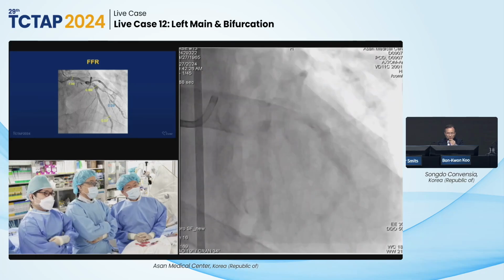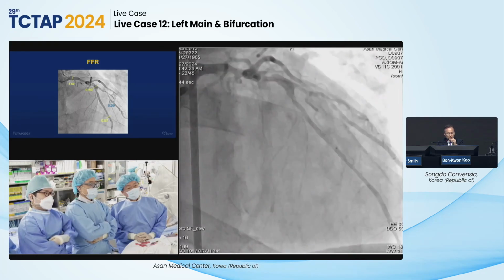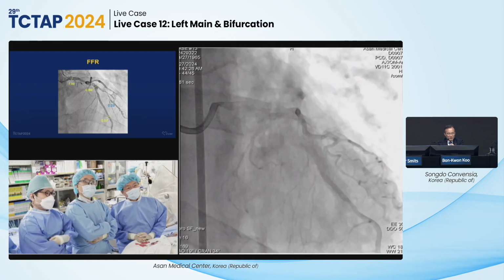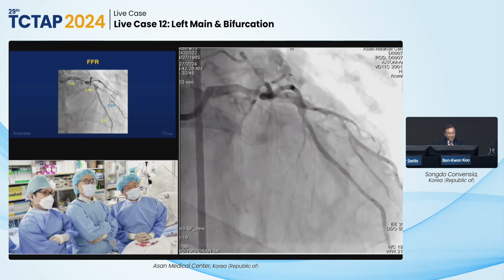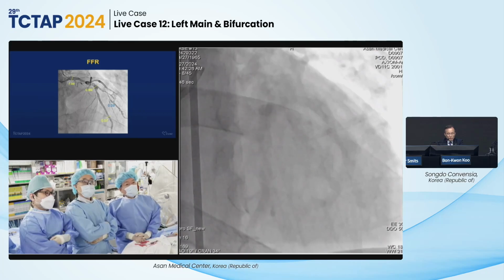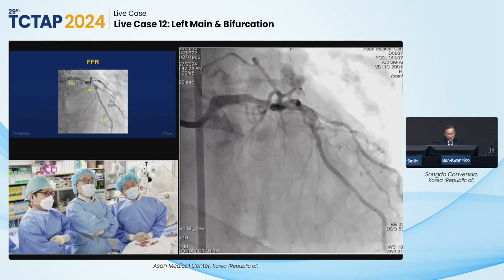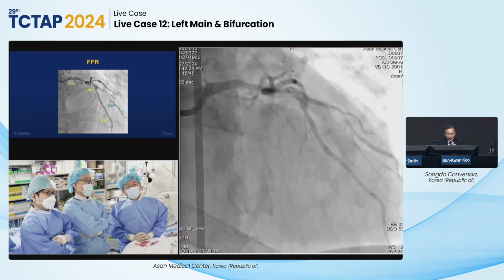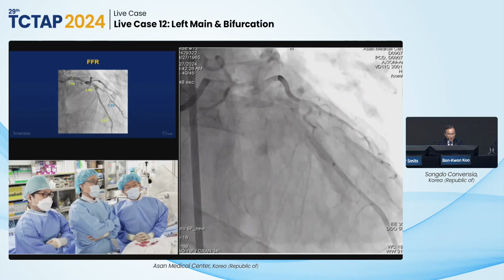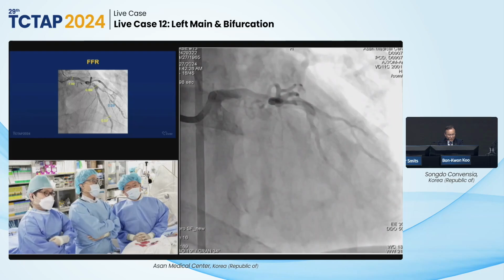And as Dr. Werner said, the delta of the distal lesion, 0.69 minus 0.57, will increase after fixing the primary lesion, but we'll see how much it improves. This patient also has diffuse myocardial bridging, and above that a very focal, intermediate-looking stenosis, and we'll see. But anyway, it is very straightforward that the distal left main and proximal LAD should be treated first.